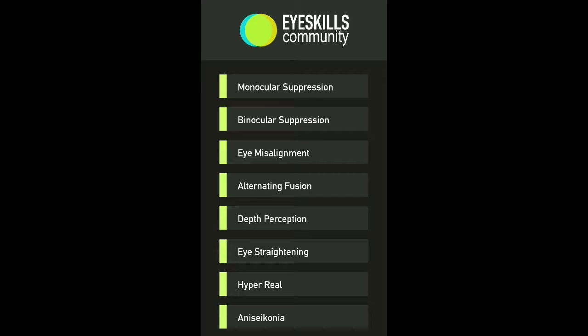So the monocular suppression example is actually just something for testing what each eye can see individually. If I go into there by pressing E, it'll ask you to put the phone into the viewer, and in this case we see a small grey star in the right eye. I can make it brighter by pressing W, so up, or darker by pressing X, 10% brightness. And by holding down W for a second or two, it pushes it further away, makes it smaller.